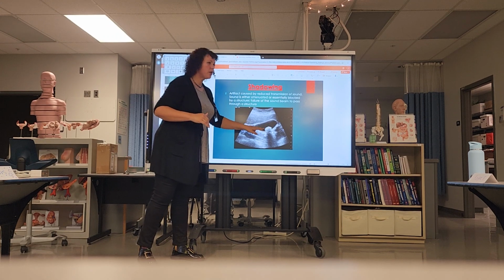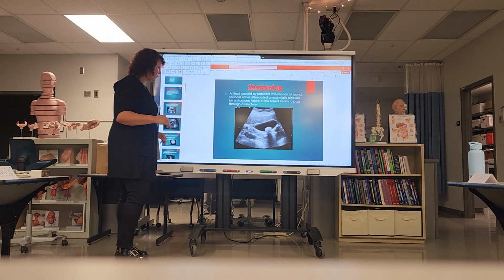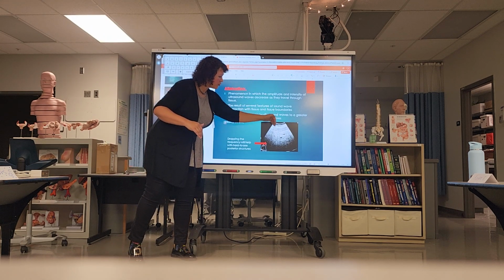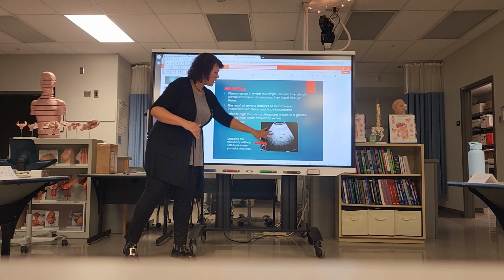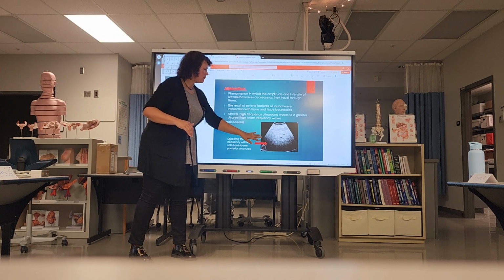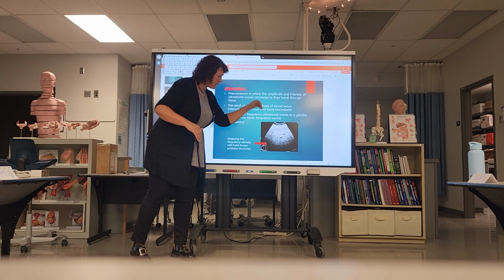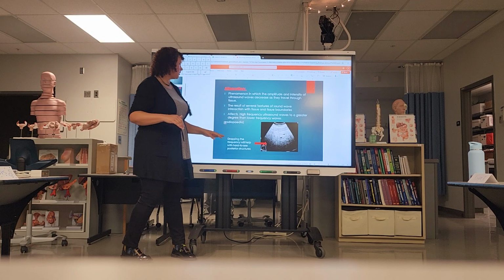This is just losing information because we can't penetrate through all of this tissue. So it's not shadow, it's just a loss of information because the sound beam can't penetrate all the way through. Does that make sense?